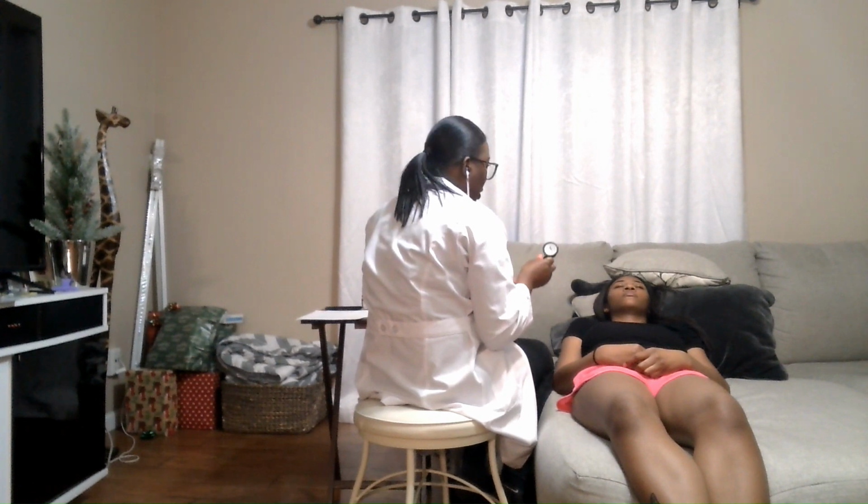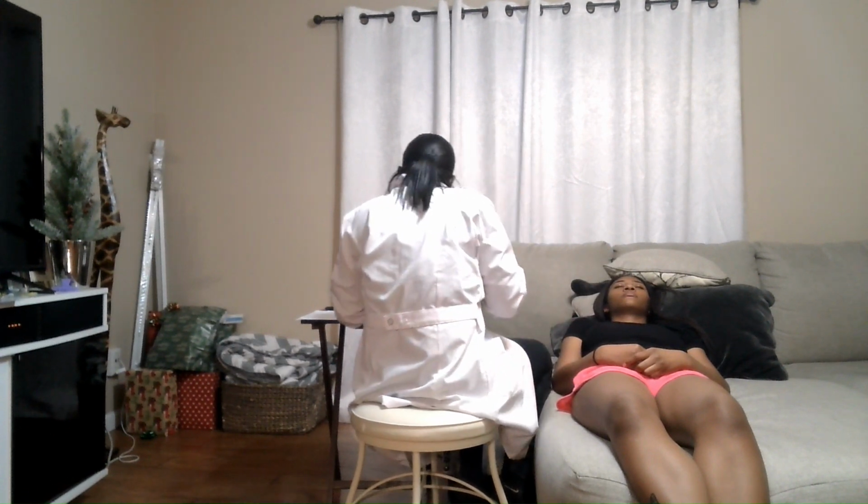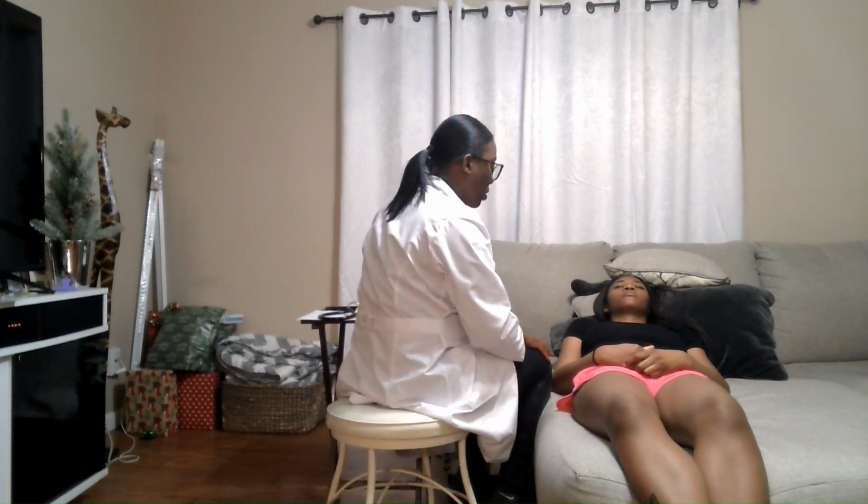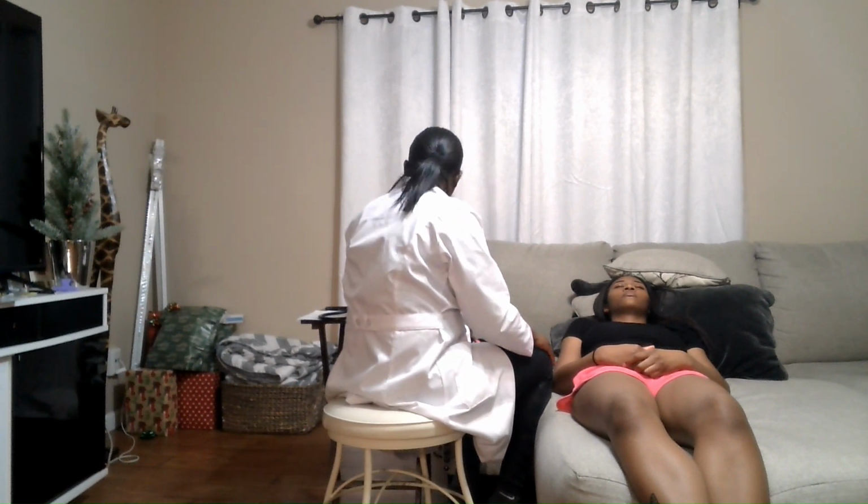Now I'm going to check for murmurs in all 5 of those locations. Aortic, pulmonic, Erb's point, tricuspid, mitral valve. I didn't hear any murmurs or bruits. I didn't hear any abnormal heart sounds like S3 or S4, or any splitting noted.